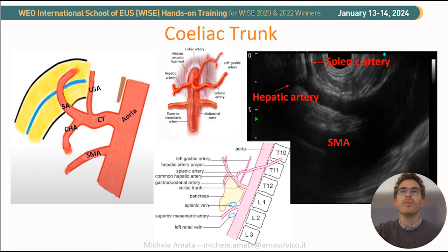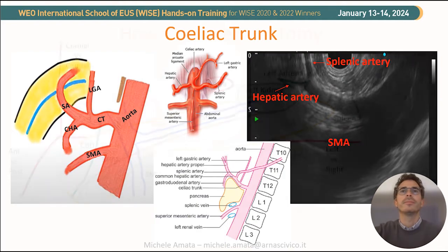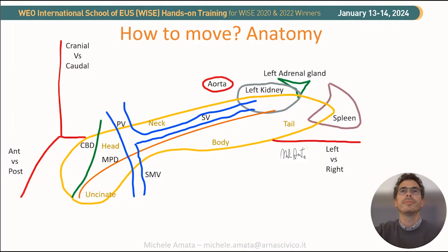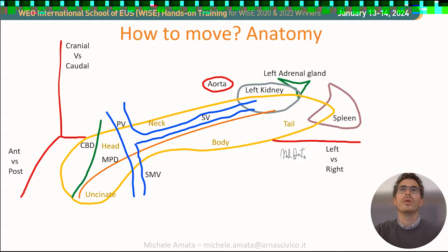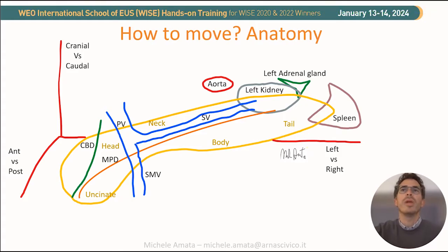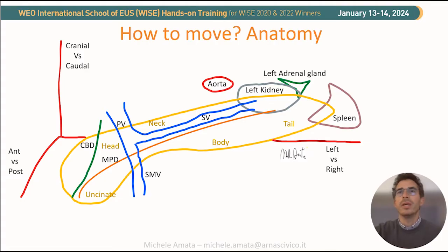From this position, by pushing the scope slightly and moving down the big wheel, we will reach the pancreas. It is important to know that the pancreas is in an oblique position, with the body and tail in a more cranial location compared to the head. The body and tail are on the left side of the body, near the left kidney and the spleen. It lies behind the stomach in a retroperitoneal position.